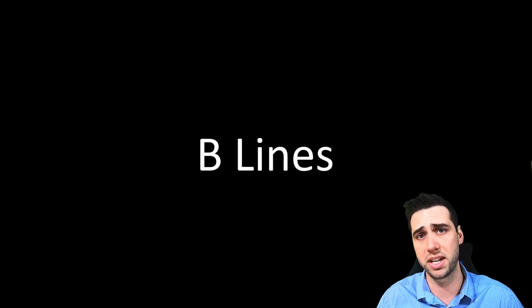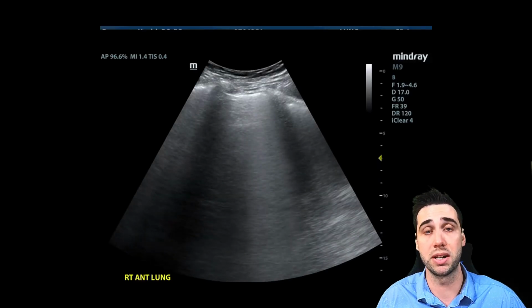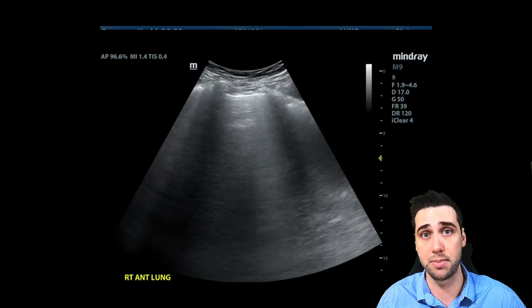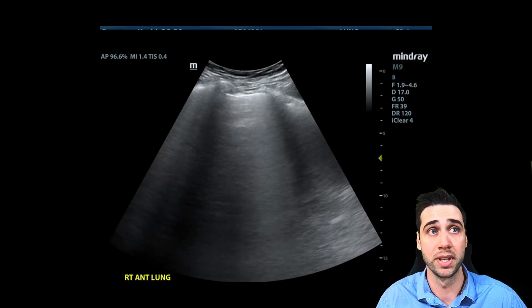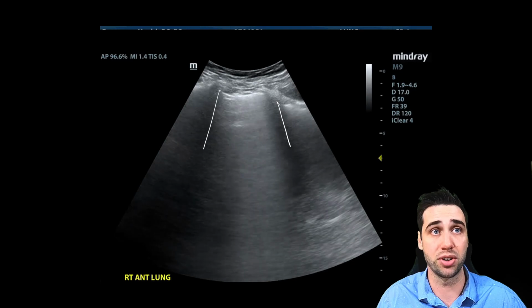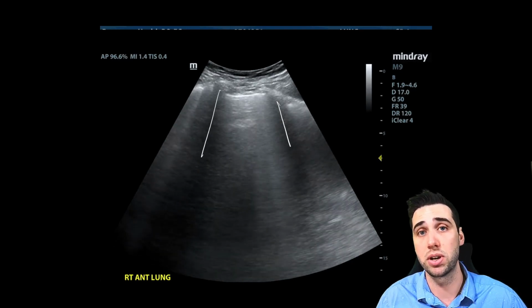The other couple things that I want to talk about is B-lines and A-lines. We already discussed A-lines, but let's look at how B-lines look different. B-lines can represent a number of pathologies, and we'll discuss that more in depth, but I just want you to be able to recognize them for right now. So again, we see rib shadow here and rib shadow here. In between, we see these big spotlight things. And those are actually B-lines.